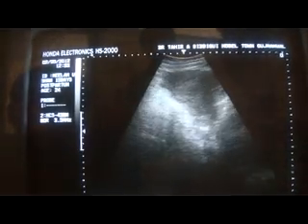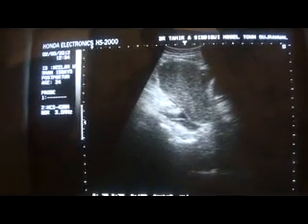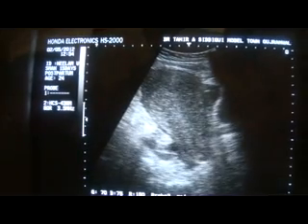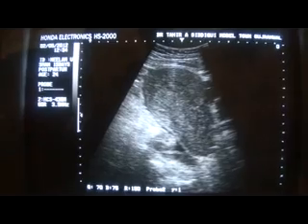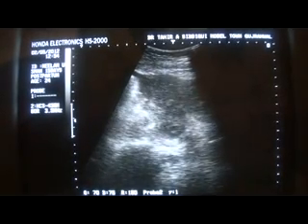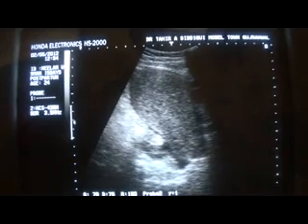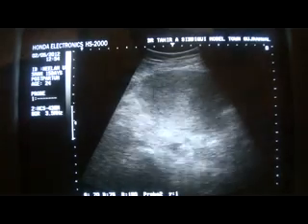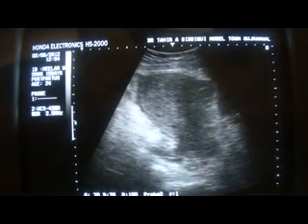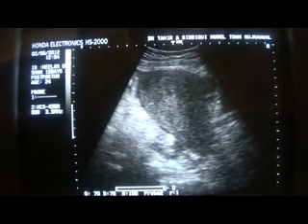Now this is the urinary bladder. This is the catheter that has been placed. And what is this area? When I maneuver the probe a bit, I can see that this is fluid, in which multiple septa are seen. This is multi-septated fluid around the anterior wall of the uterus, and here you see a loculated pocket of fluid in which these tiny linear structures, the thread-like structures, are the septa. So there is fluid in the pelvic cavity and there is fluid surrounding the anterior wall of the uterus.